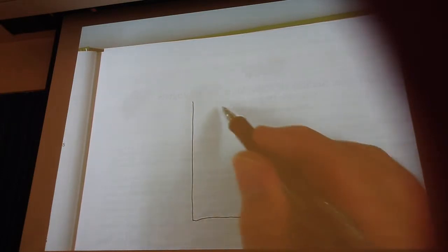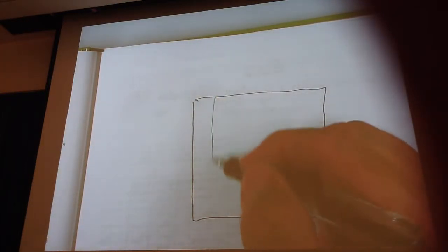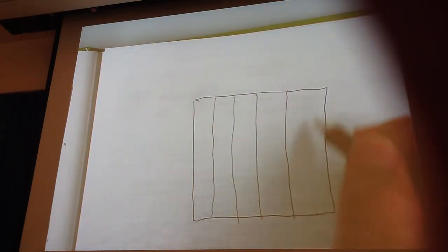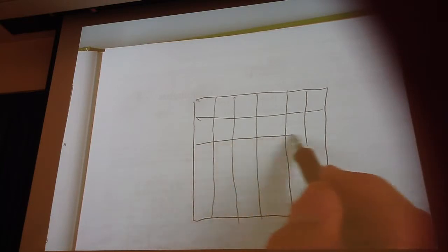Basically, the way that this works, and this is also something that we use for edge detection, let me just do this here for a minute. The first thing that we had talked about with removing certain numbers, that's going to be your high-pass filter.